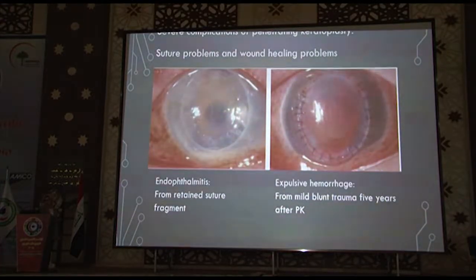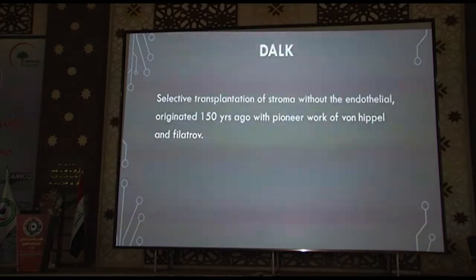This is a complication of penetrating keratoplasty, suture-related endophthalmitis, and the other slides show expulsive hemorrhage from trivial trauma. Now, what is DALK? DALK is a selective transplantation of the stroma without the endothelium, originated 150 years ago with the pioneer work of von Hippel and Filatov.